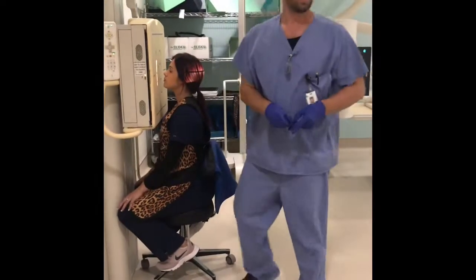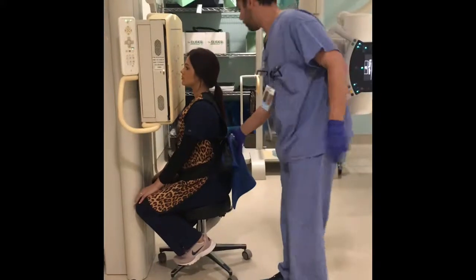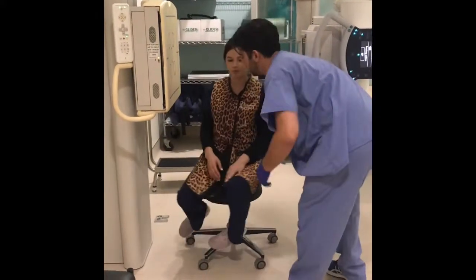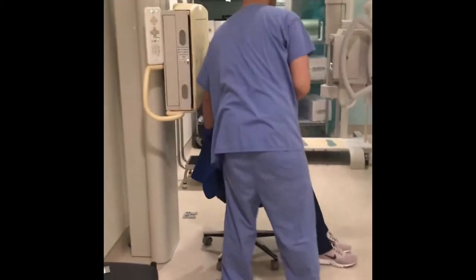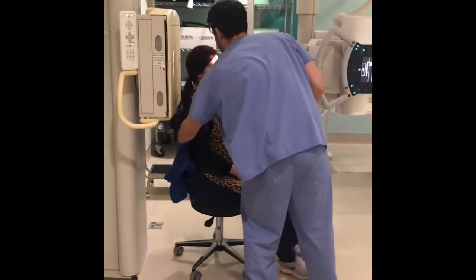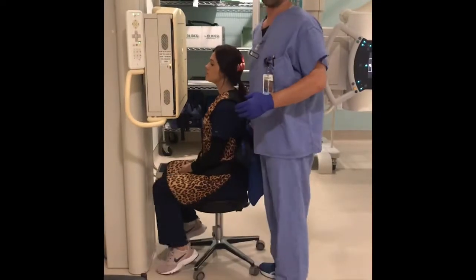So, next, I'm going to pull her out of here, and we're going to flip her around in our nice little wheelie chair. All right, we're going to scoot you back. Oh, close your eyes. Actually, that's absolutely my mistake. I'm going to be doing the Waters next.